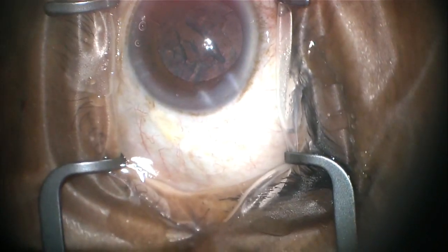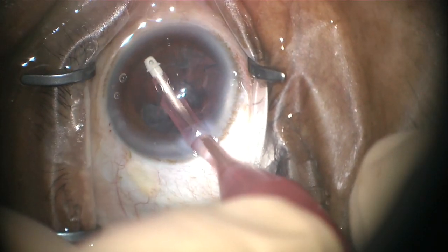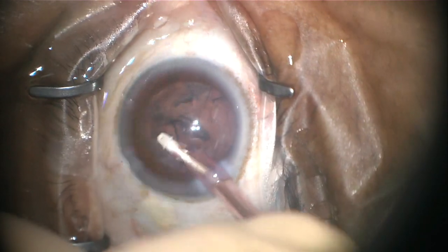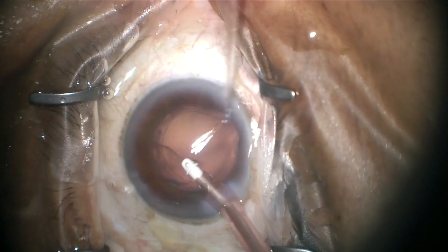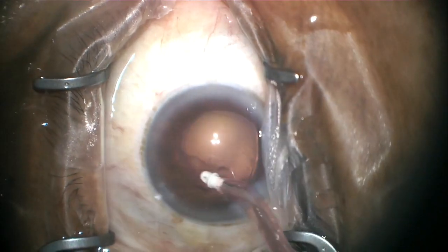Those two pieces are then removed with the ultrasound and vacuum. Once the main parts of the cataract have been removed, the remaining thin lens fibers are removed using an irrigating and aspirating cannula. Once these fibers have been removed, the lens capsule is polished until it's perfectly clear.